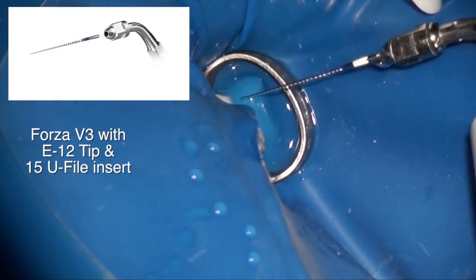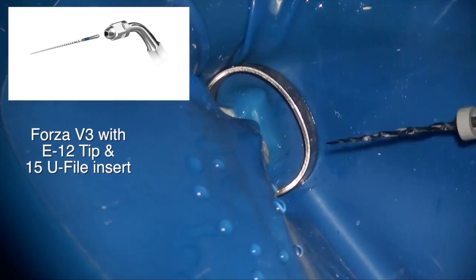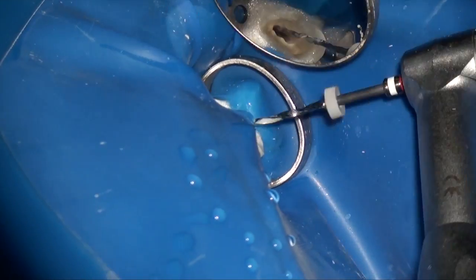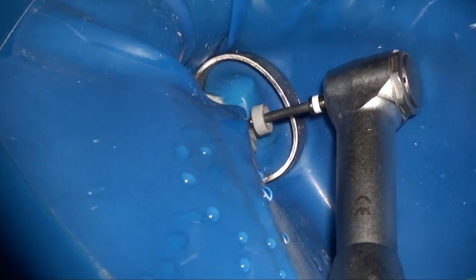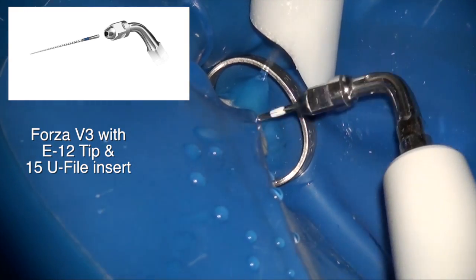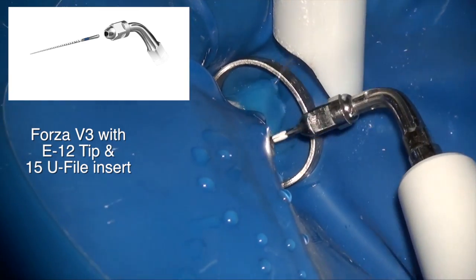It's been a little bit fast forwarded on the buccal canal now, and I'm doing this fast forward because I'm sure you guys would get pretty bored watching this in real speed, but it's important to see every stroke that's being taken in the canal, so you can really see what it takes to go from a size 15 to a size 45 and skipping all of those file sizes in between because of the booster tip that is present on the ESX file system.